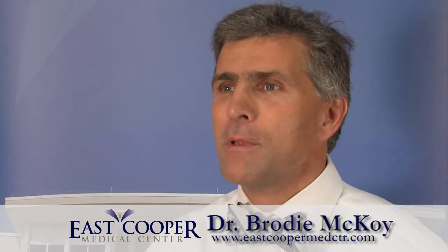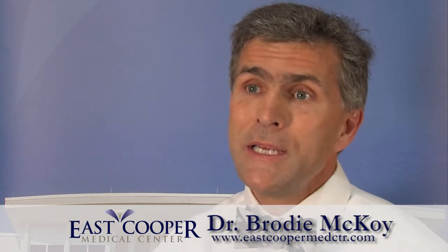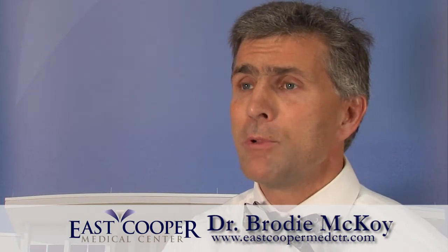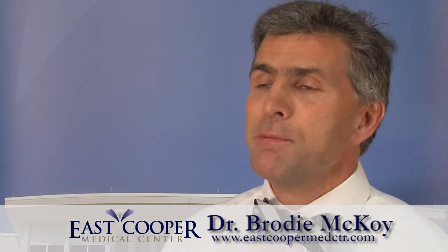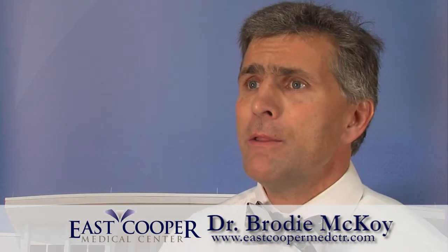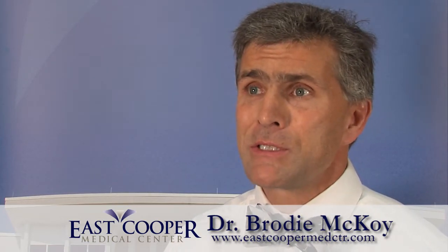This is performed as a CT scan is performed of the patient's lower extremity. This information is fed into a computer which allows us to make a 3-dimensional model of the knee. On this 3-dimensional model, we can place the implant in various positions to find the ideal position for the implant that is specific for that patient. We can virtually perform the surgery as many times as necessary to find the ideal position for the implant. This will allow us to precisely place the implant and obtain ligamentous balancing.